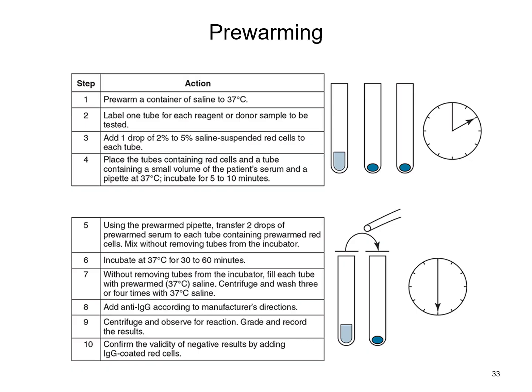So the pre-warming, again, you're going to go through those steps where you're going to pre-warm all of your containers. So your tubes will sit in the incubator. Typically, you're going to put your reagent cells and things already in that. Your reagents will be in the tube. So you've got to deviate from usual normal procedures. And maybe you're going to incubate your cell suspension and your serum for a few minutes, and then you're going to add those tubes while they're actually sitting in that incubator.